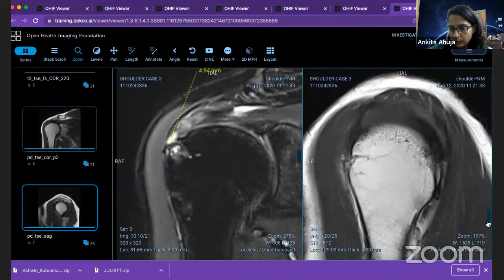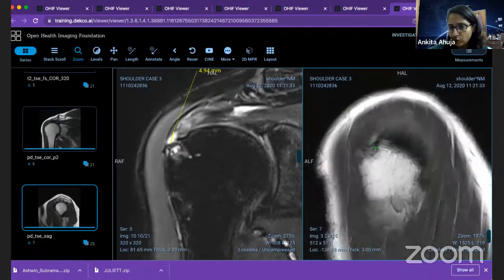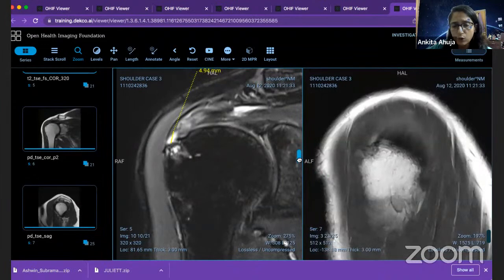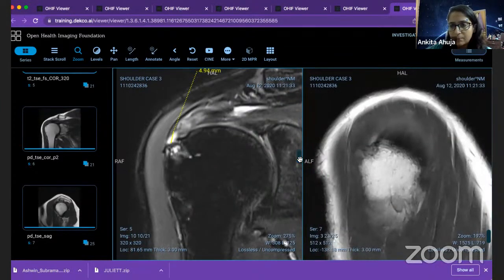So this is all moderate tendinosis. And as I approach over here, I see this small fluid signal, which corresponds to almost my mid supraspinatus fibers. So how would you describe it? Overall, there is moderate supraspinatus tendinosis with a partial thickness, bursal-sided supraspinatus tear involving at least 50% of the tendon thickness. And you also give a measurement on your AP dimension of how much it is measuring.